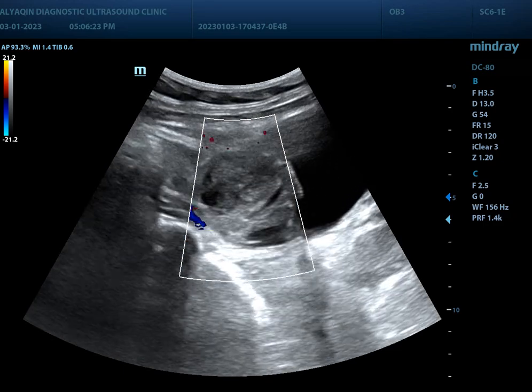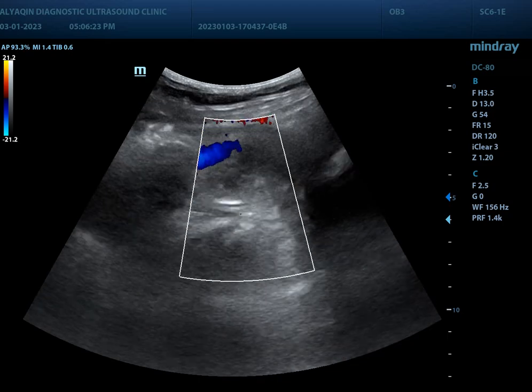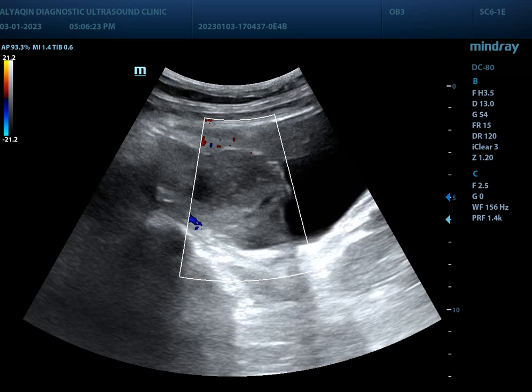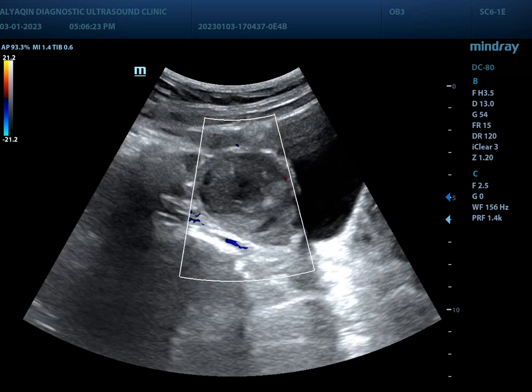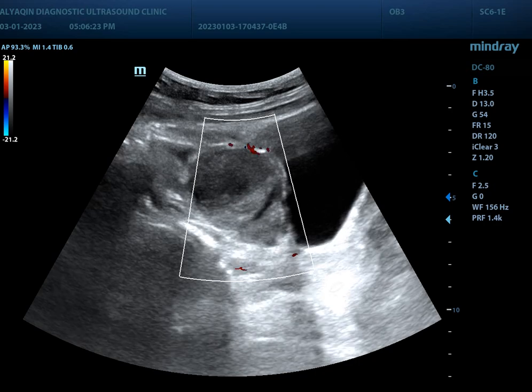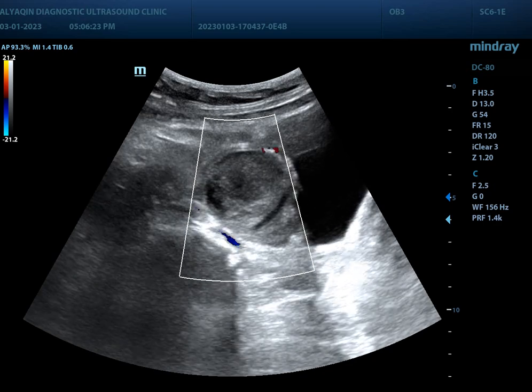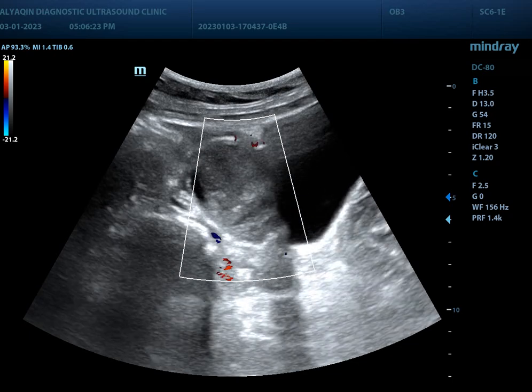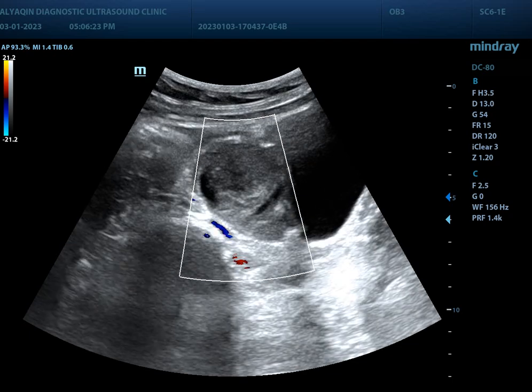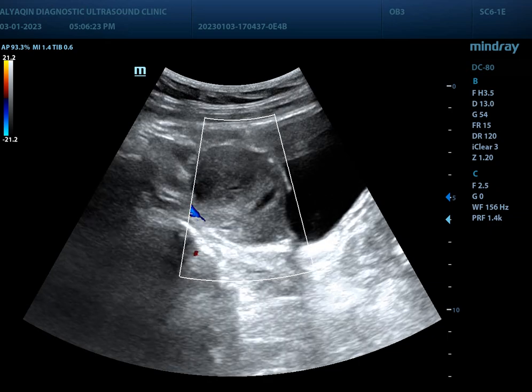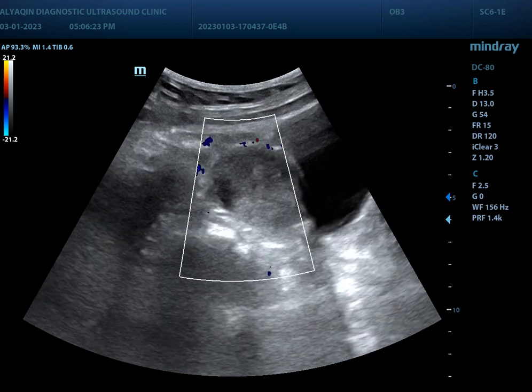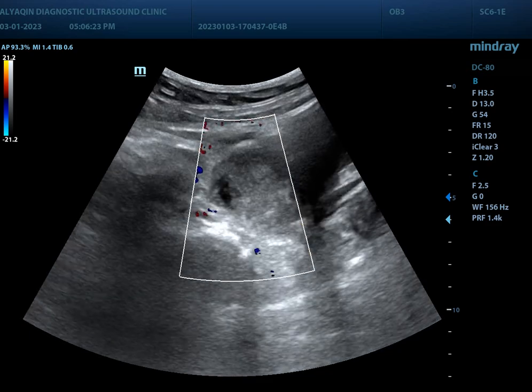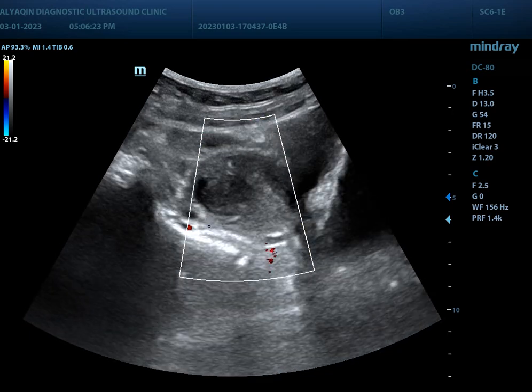Tilting the probe to the right, here there is a complex texture cystic mass. The mass is fluid-filled with thick tissue inside it. There is no internal vascularity on Doppler study. This is a picture of hemorrhagic cyst of the right ovary.